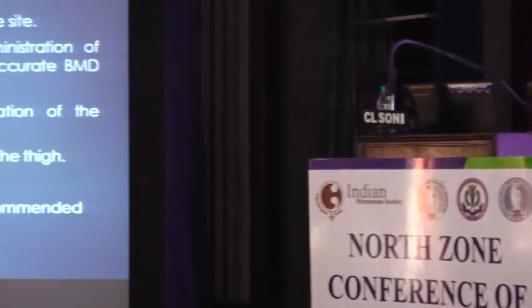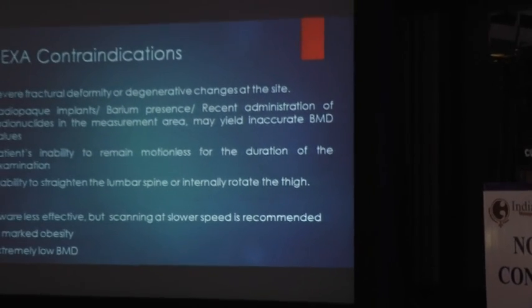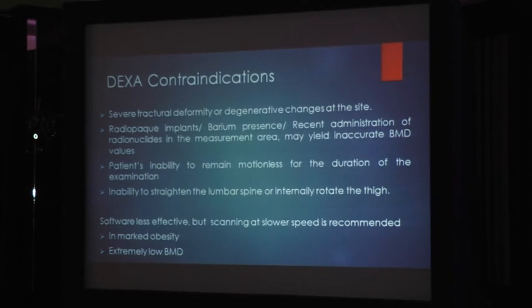But DEXA does have contraindications also. If there is a fracture deformity or degenerative changes at the site of the DEXA, it cannot be used. If the patient has a radiopaque implant, barium presence, or recent administration of radionuclides, it cannot be used.